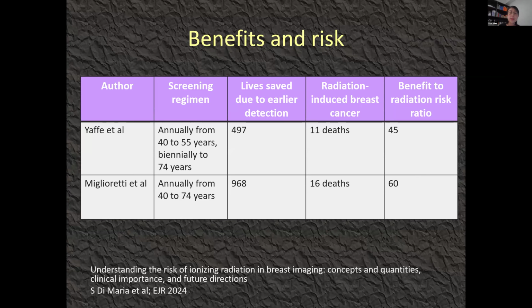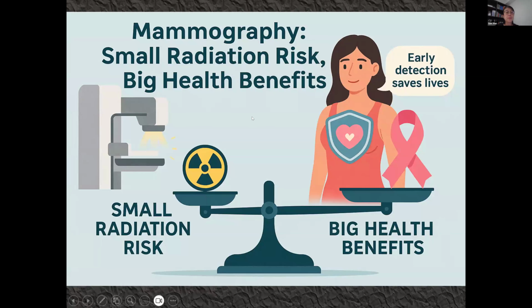the consideration of the large number of lives that have been saved because of early detection is something to be noted. So therefore, we balance a small radiation risk with large health benefits by early breast cancer detection.